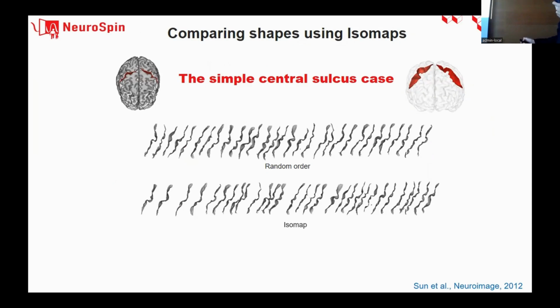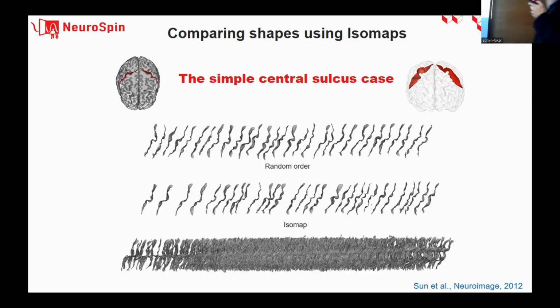And you realize that now you get on the left the ones who have just a deformation in the middle, and on the right some who have several deformations. And you can do that with 30 brains or 1,000 brains. You always get the same variability, which is this knob here moving up, letting some space for another knob here.